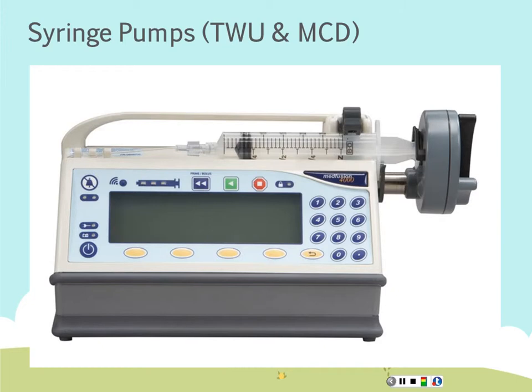One of the best ways to ensure accurate fluid administration is to use infusion control devices such as infusion control pumps, syringe pumps, and volume control sets to help deliver your IV fluids and medications. The primary method for IV medication in children is the syringe pump. It allows you to deliver a highly precise rate of medication at a controlled rate of infusion that's more controlled than IV push. Anything from 1 to 3 mL all the way up to a 60 mL syringe will fit in these.